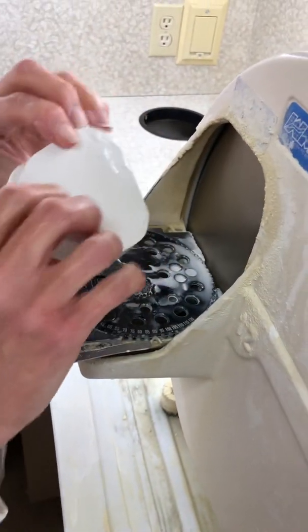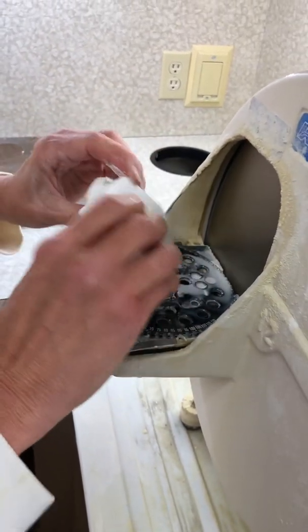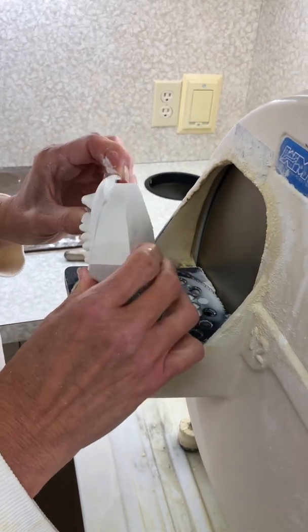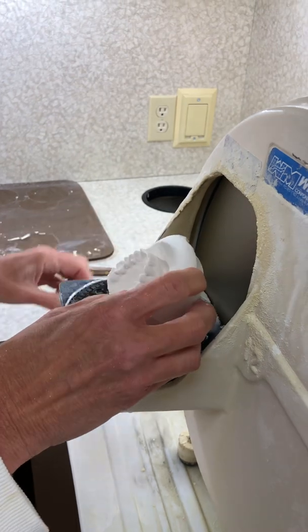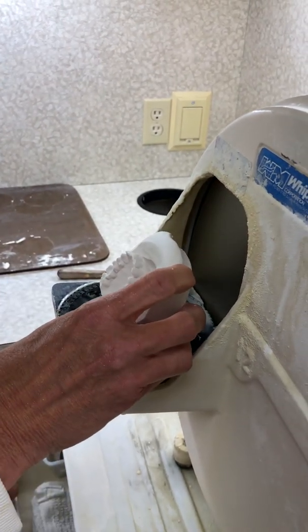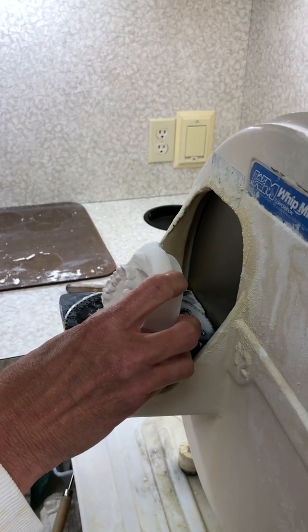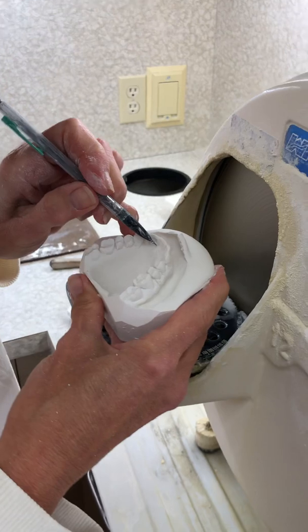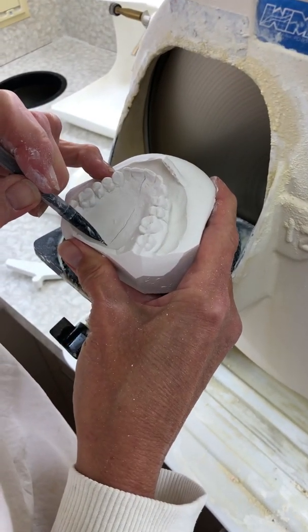Now, there's a little bit left at the back here, and I'm not going to worry about that right away. You can take it off if you want, but I want to make sure that I've got enough of my bases that I'm not going to run into trouble. So the next step we want to do is I'm just going to get a pencil. And we're going to mark the palatal suture line. So it starts up there and runs down.